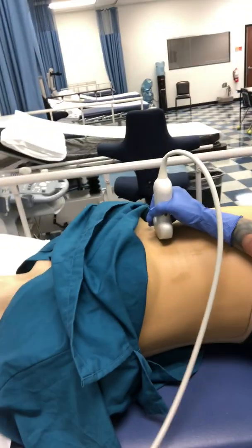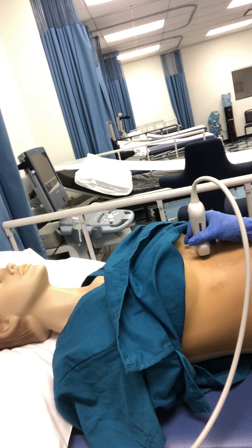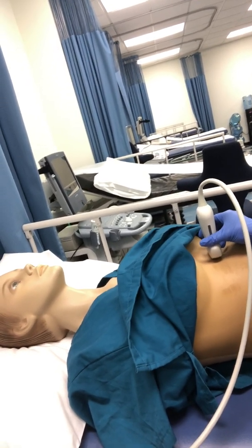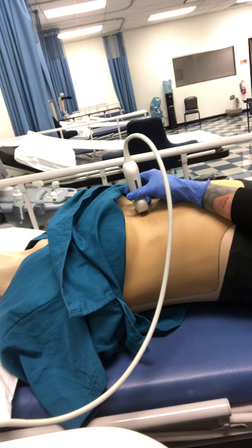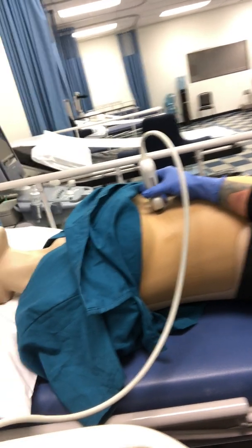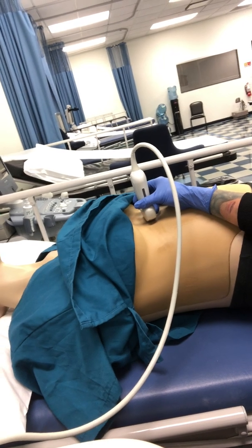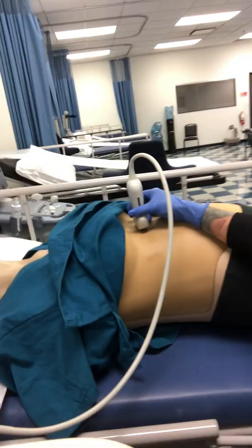So again, if we look at our probe on the patient, you can see the notch is pointing towards me, or the patient's right, and then the opposite side over on this side is pointing towards the patient's left. Whenever we discuss the actual orientation, it's always in regards to the patient, not ourselves. So yes, this notch is pointing towards me, but it's pointing towards the patient's right-hand side because of the way that the patient is laying.